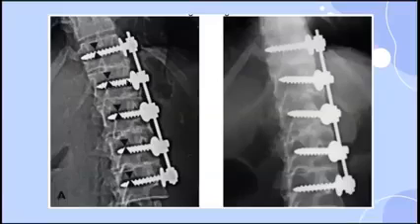As you can see, the edges of the screws are more identified. The spatial resolution is high because the structural lines are visible, but there is an increase in noise. There is a speckled appearance in this image compared to this image. Here there is lesser noise, but the edge enhancement is not that great.